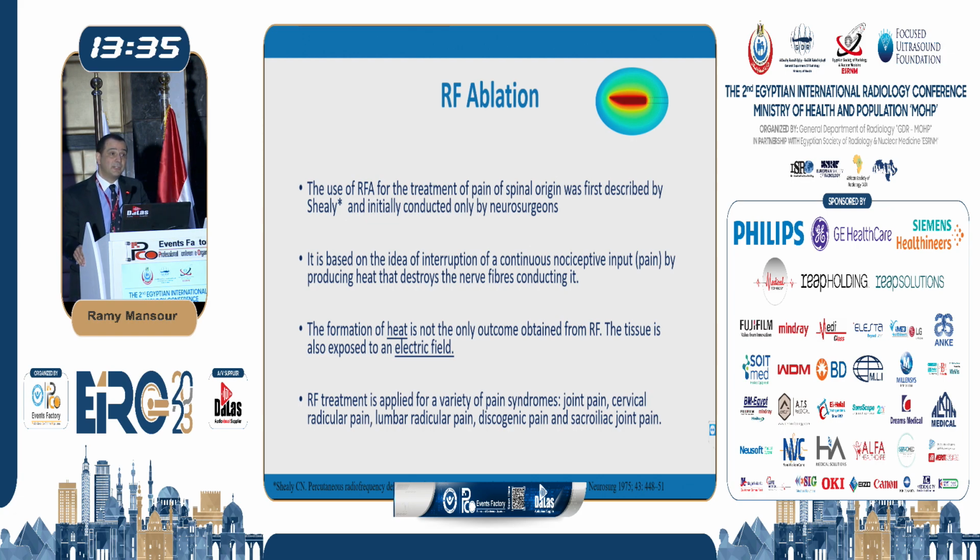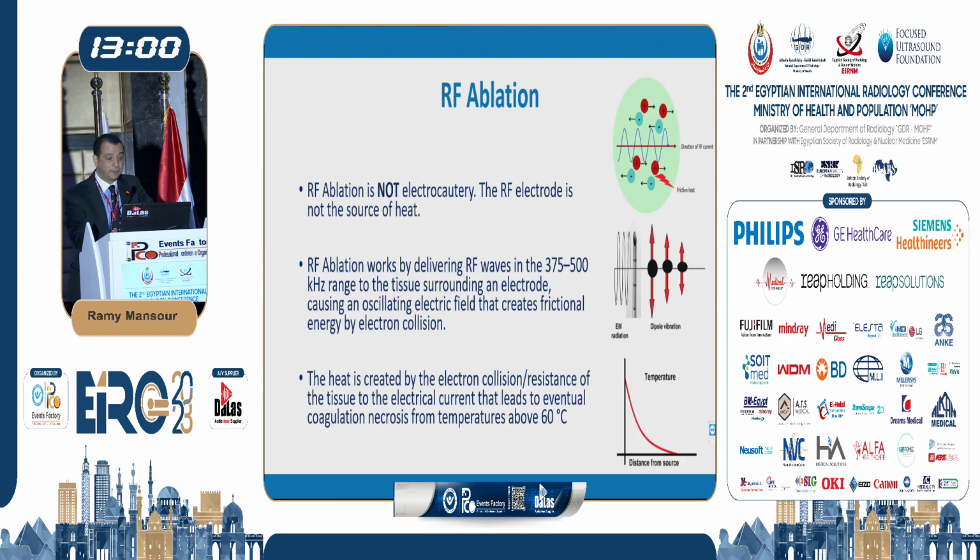It is based on interruption of the pain signal, what we call the nociceptive input. But the added advantage of radiofrequency is not just the production of heat, it's also the electric field produced around the electrode. So we have two advantages: the production of heat and the production of the electric field. So we can use it in any pain syndrome in our body, either the spine or peripheral nerves.